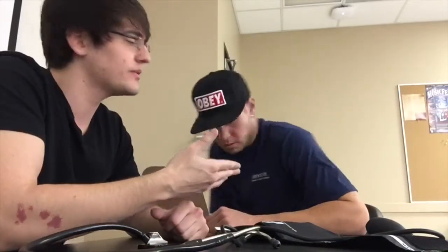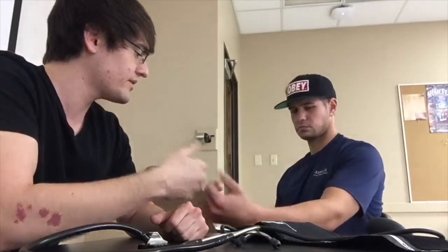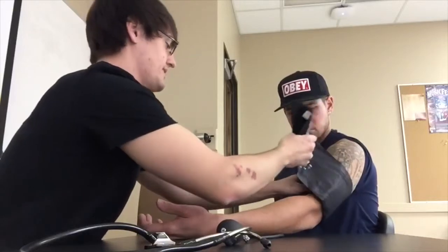You want to make sure that their body position is correct. You want to have your upper back against the chair, feet flat on the floor, and your left arm extended and slightly bent. Alright, we can begin putting the blood pressure cuff on now. You want to put it just above the crevice in the arm, in line with the brachial artery.